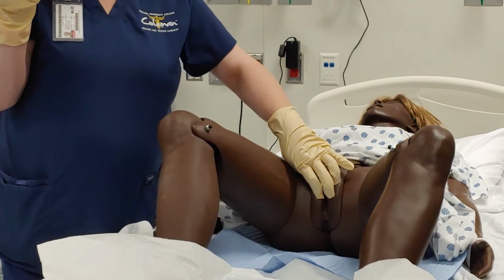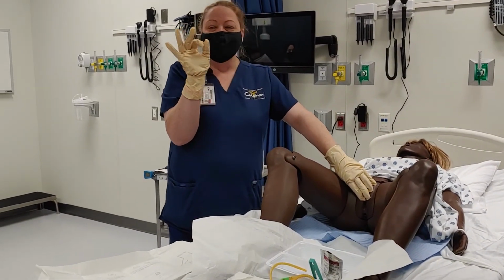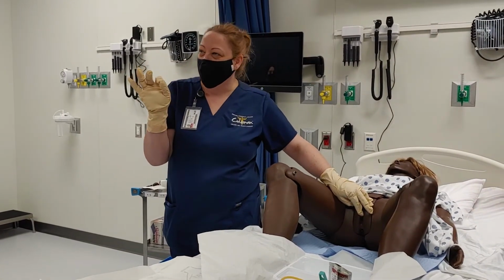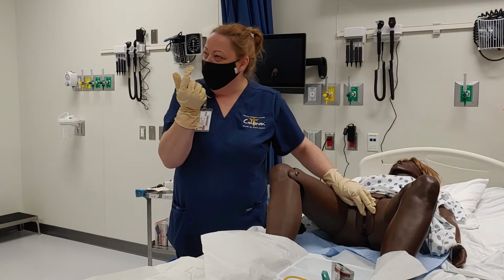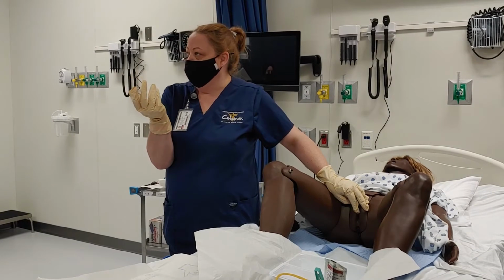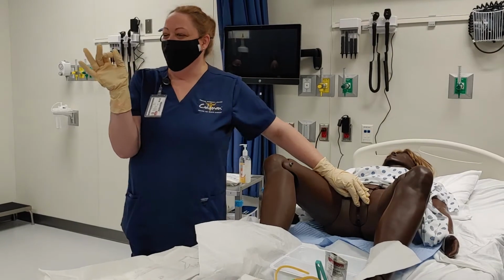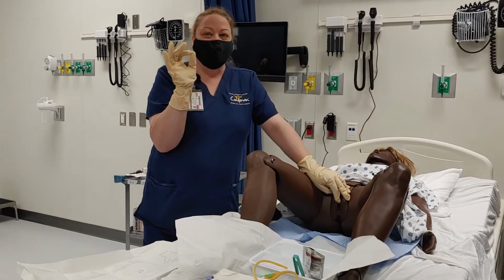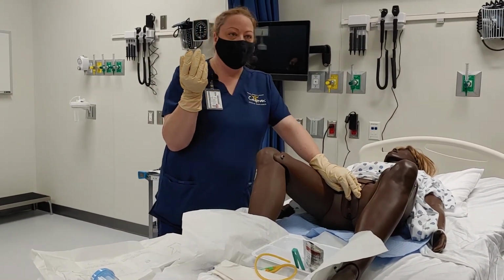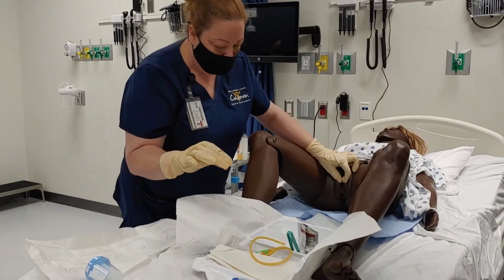All right, now it's important to remember, on ladies, we have multiple orifices down there, okay? We have one little area that kind of looks like a hole, but not really, and that is the clitoris. We have the urethra that is underneath that. Below that, we have the vaginal opening, and below that, we have the rectal opening, okay? Make sure you know your holes, all right? It has not been an uncommon thing to accidentally or inadvertently get the catheter inside the vagina. It happens. If it does, start the whole procedure over. Okay, so I'm going to try to hold this open.